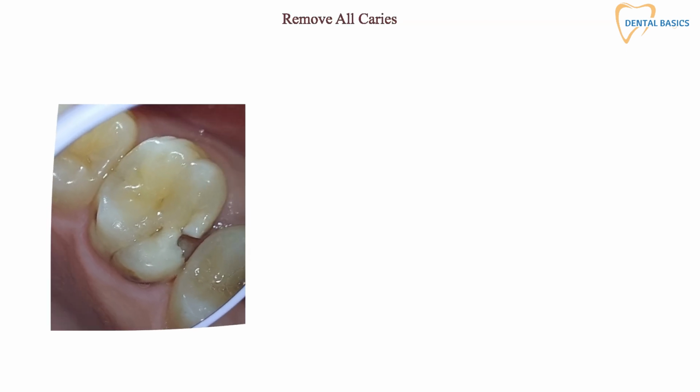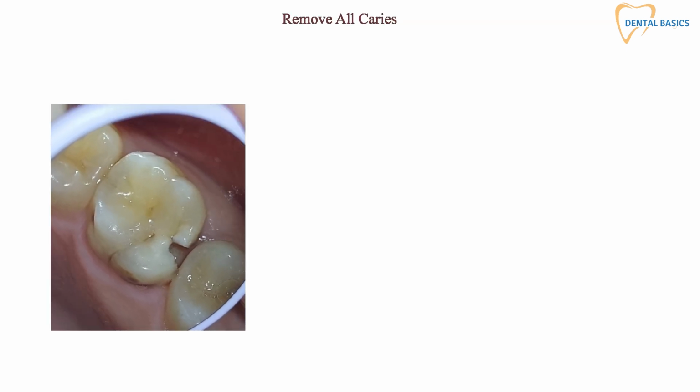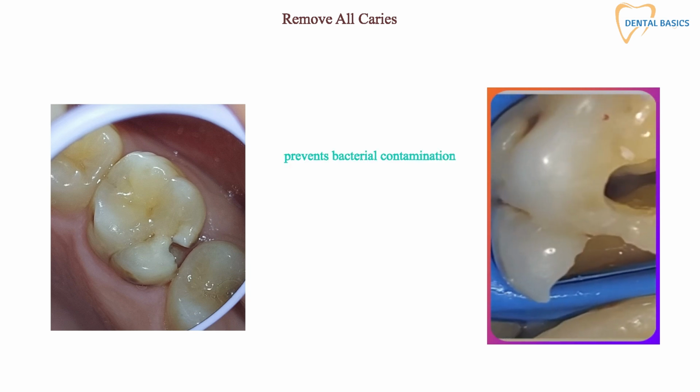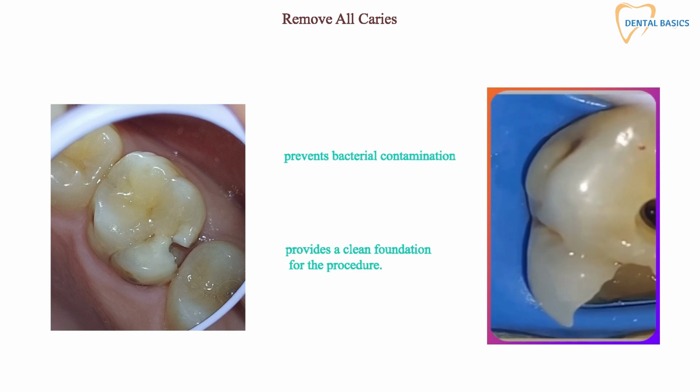The first step in access cavity preparation is to completely remove all decayed tooth structure. This prevents bacterial contamination and provides a clean foundation for the procedure.